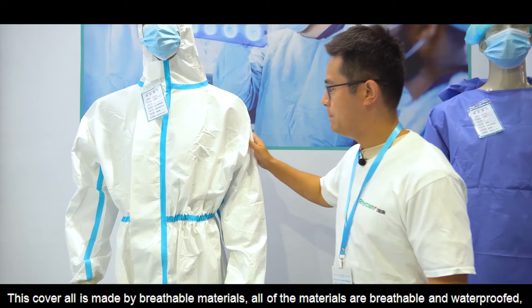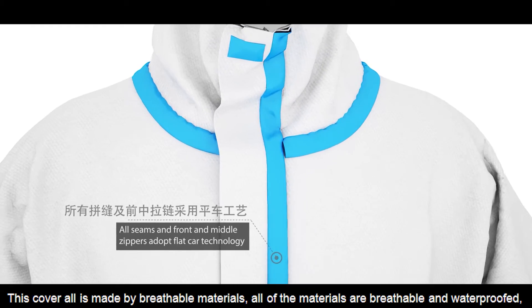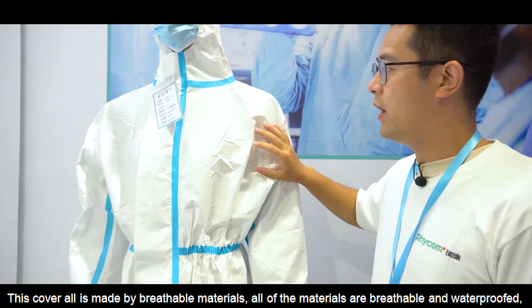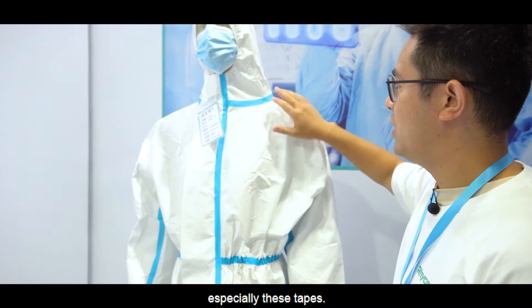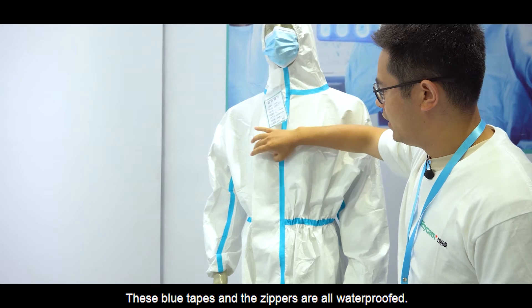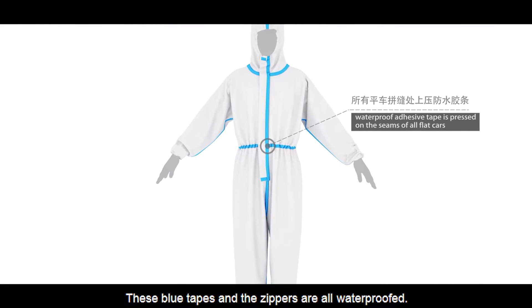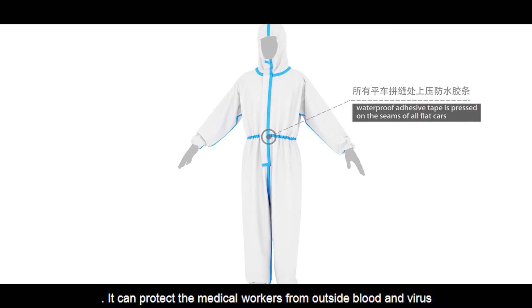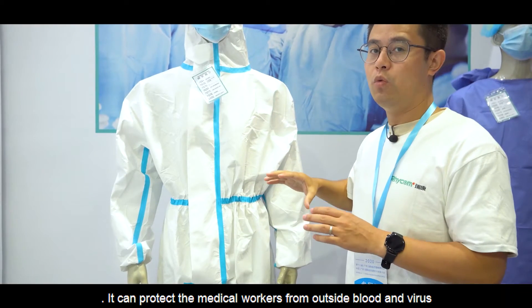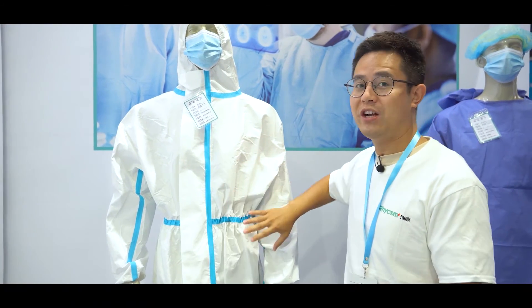This is made of breathable materials. All of the materials are breathable and waterproof, especially the tape — these glue tapes and the zippers are all waterproof. It can protect medical workers from blood and virus infection effectively.